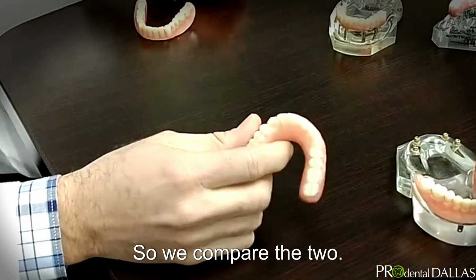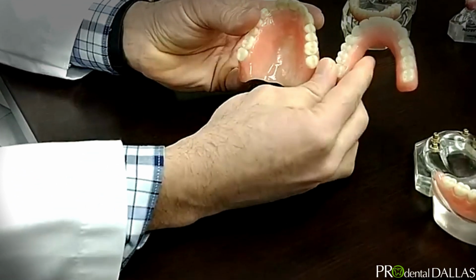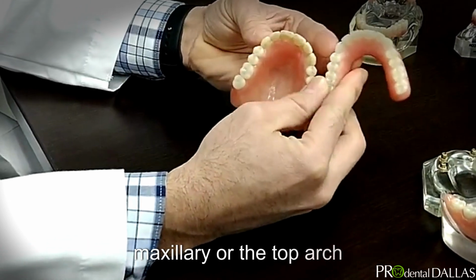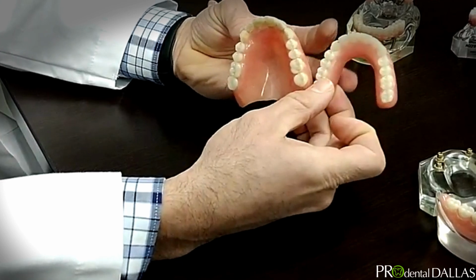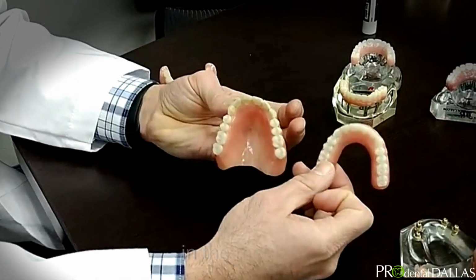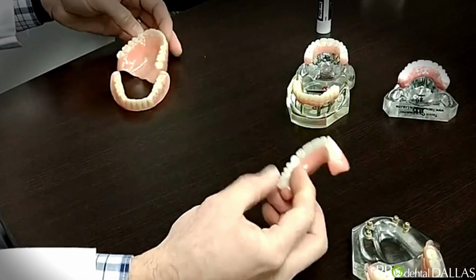So we compare the two. A conventional denture has a palate. An overdenture on 4 implants for the maxillary or the top arch has no palate. And you can automatically tell most of the time which you'd rather have in the mouth. This is larger, but it has to be in order to create the suction.